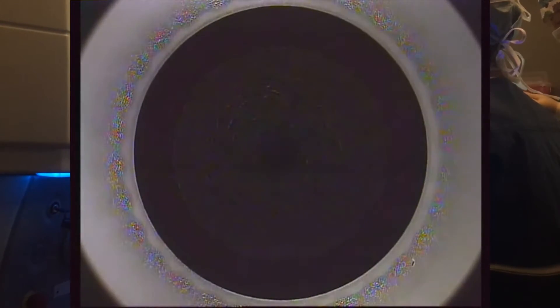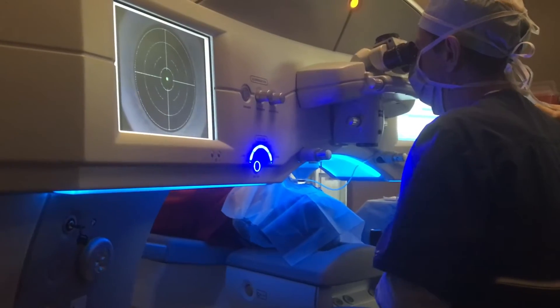Finally, the procedure is begun and you can see the cutting of the posterior cut of the lenticle, which is the most important since this is the refractive power cut. After this, the anterior cap cut will be made and finally the entry cut.